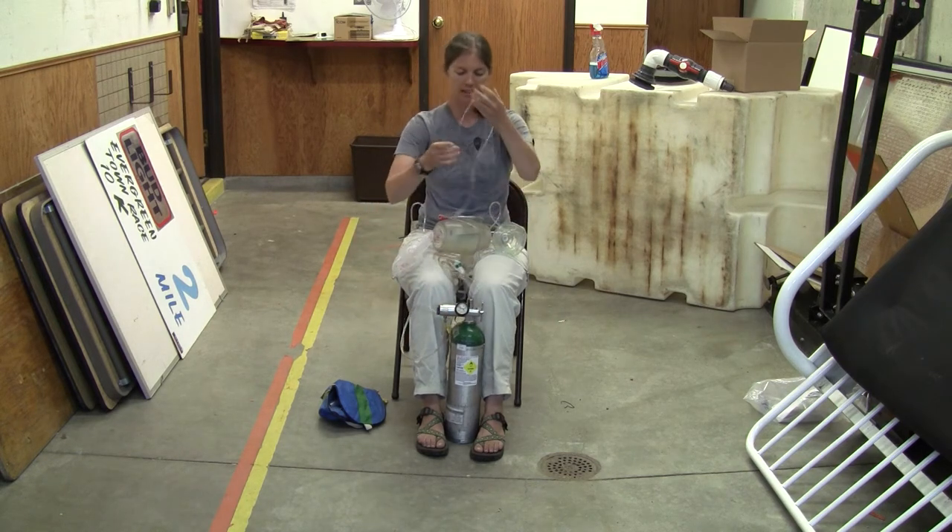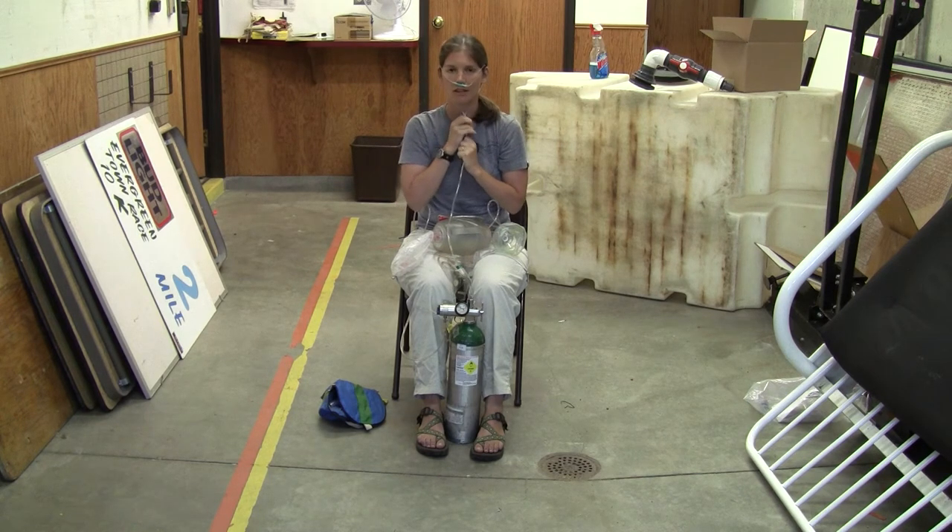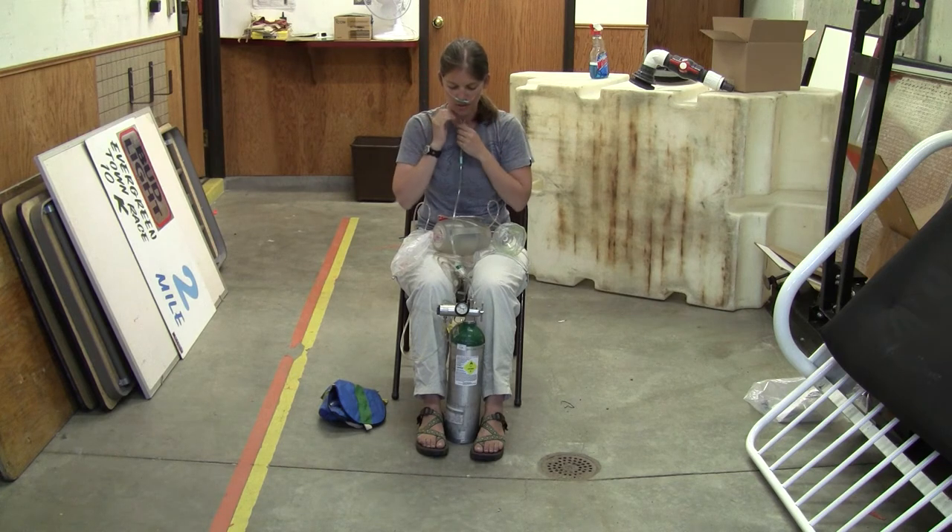You adjust your flow where you'd like to see it. Your cannula goes on the patient like this, hooking over their ears, and then you can adjust here accordingly, just for their comfort.